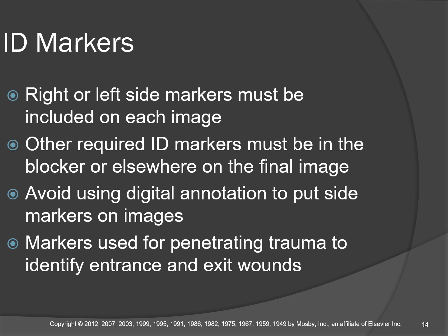And trauma X-rays are more likely to be utilized in a lawsuit than run-of-the-mill routine X-rays. Not necessarily, but think traumatic injury: if it's not the patient's fault, if it's some other entity's fault, well, there might be a suit for medical damages. And so you don't want to have the claim denied because your radiograph wasn't up to the legal standards. So use your radiopaque markers, especially on trauma.